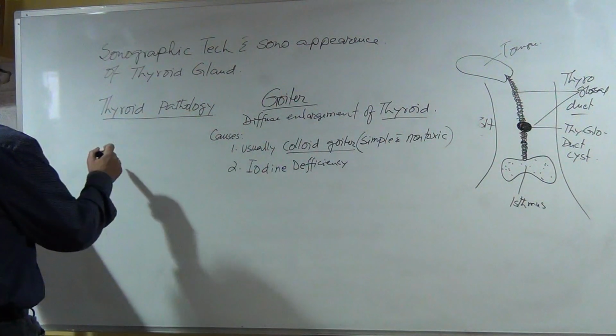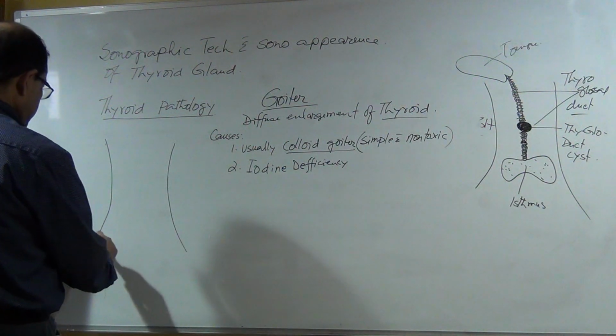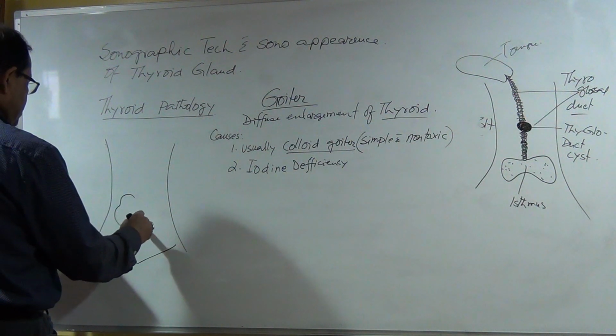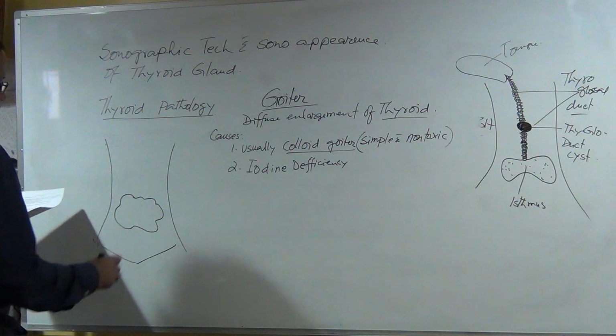That means if this is the neck, then the thyroid gland has a nodule.